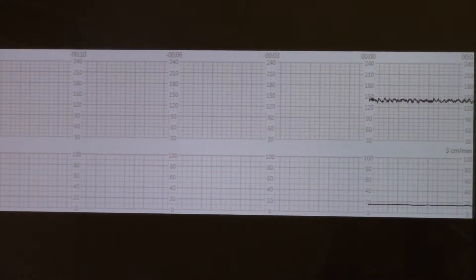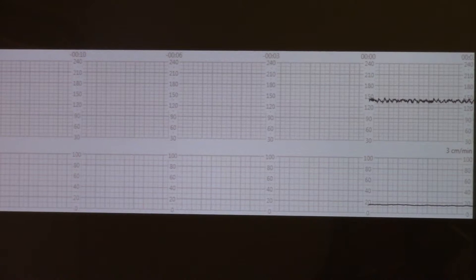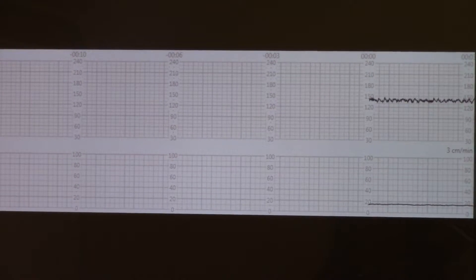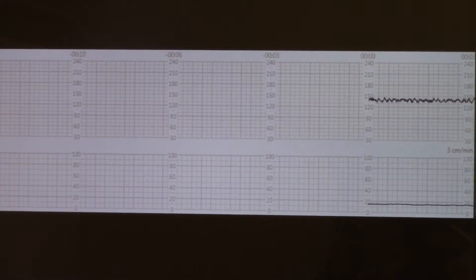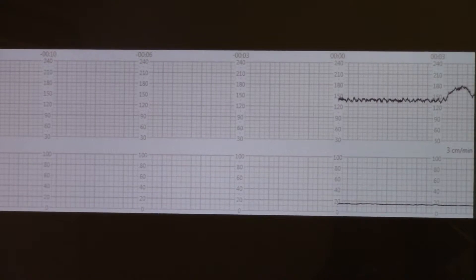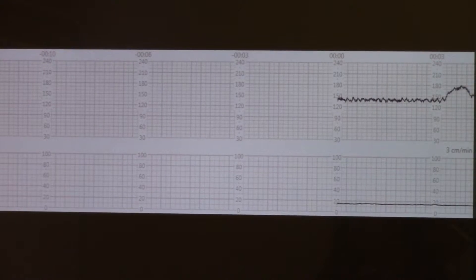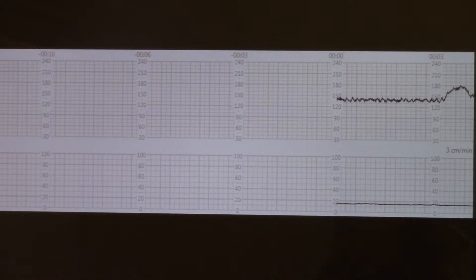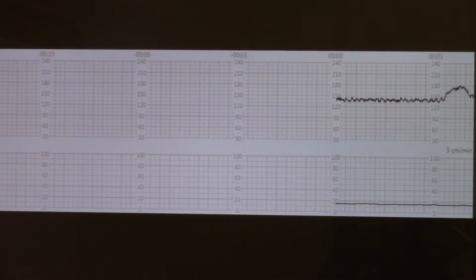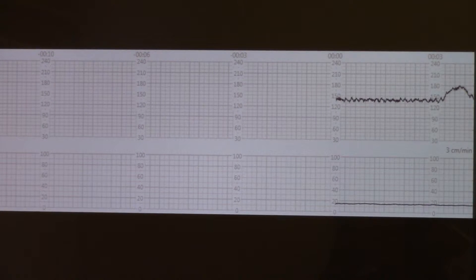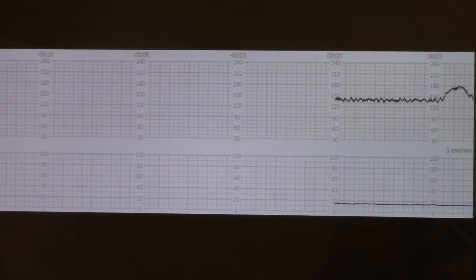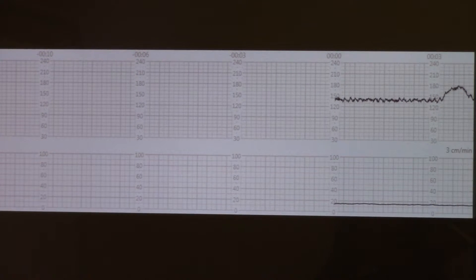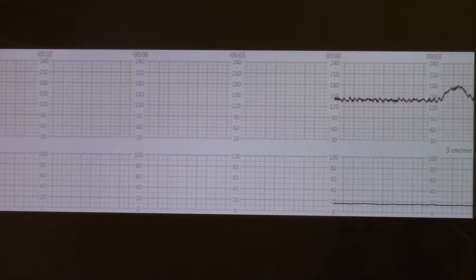Can you hear the baby's heart rate going? You can hear the heart rate go up, and now you see a fetal acceleration.